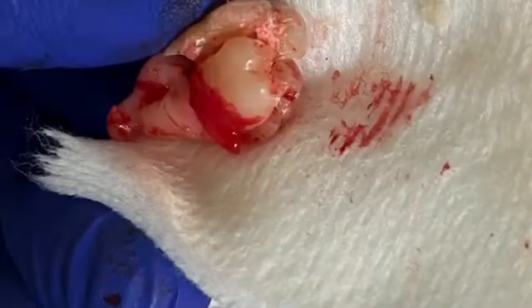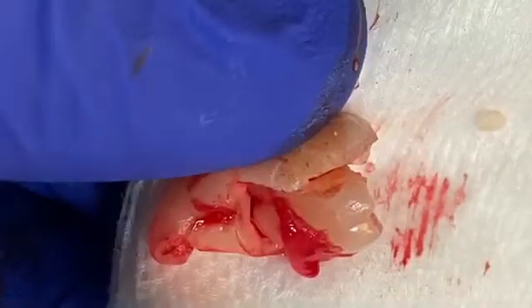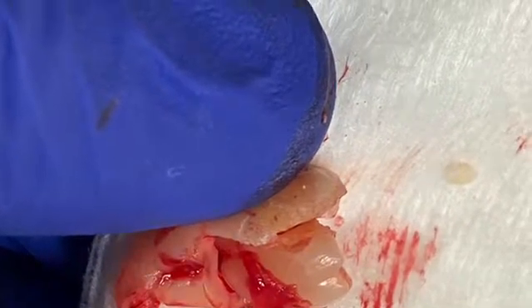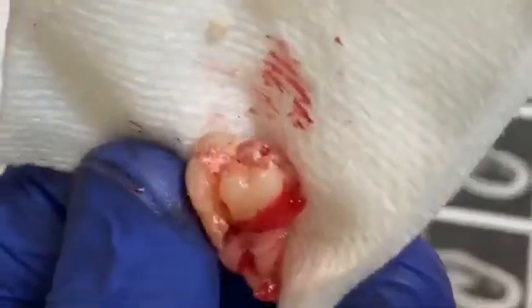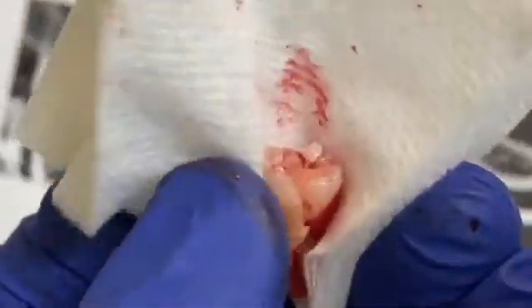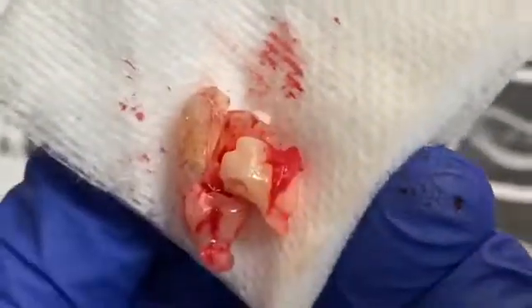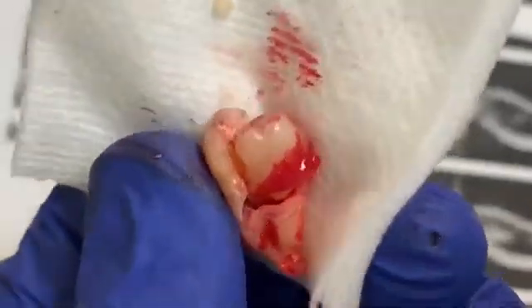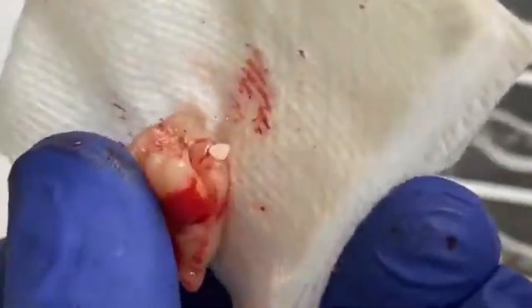I actually had to use the surgical handpiece to section the tooth into two, but when I split it, it broke — so that's the reason we had to remove it in three pieces. Anyway, this is how the tooth came out; the root is really curved.